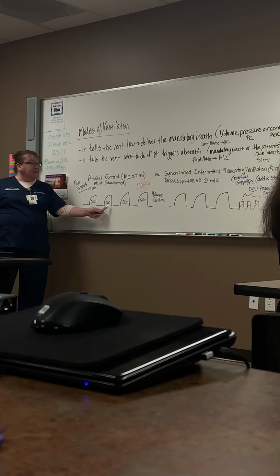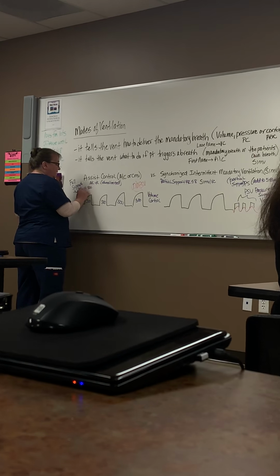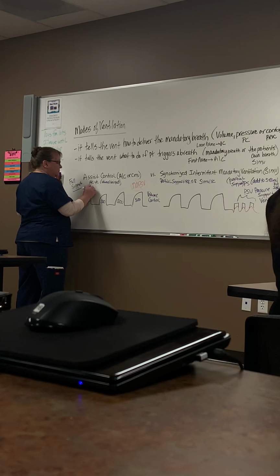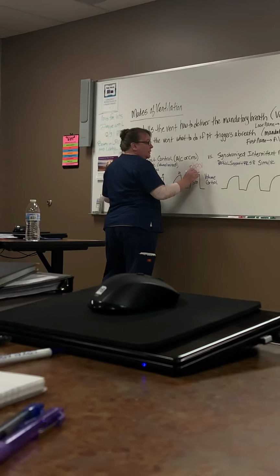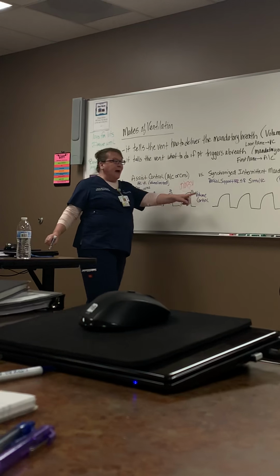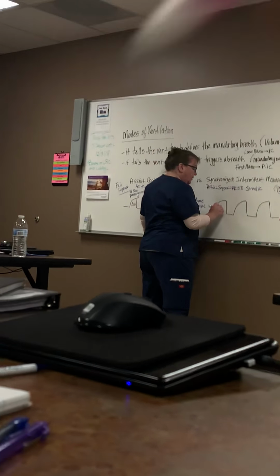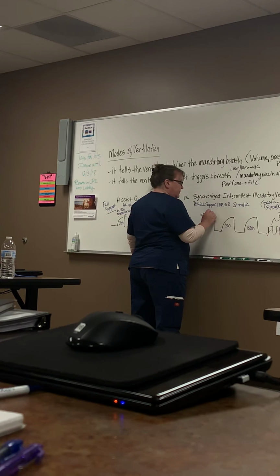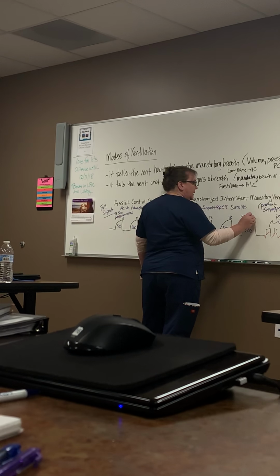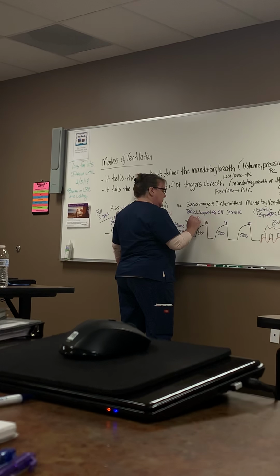So my volume is gonna stay constant, so what is gonna change? My pressure, yep. So pressure varies. My pressure here might be 15, now it's 18, now it's 20, now it's 23. The exact same concept applies over here on these machine breaths. So same thing, 500, 500, 500, and a pressure that varies, 15, 18, 20. So tidal volume 500, pressure varies.